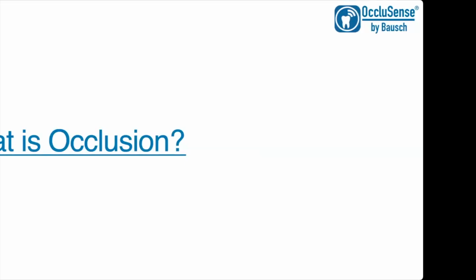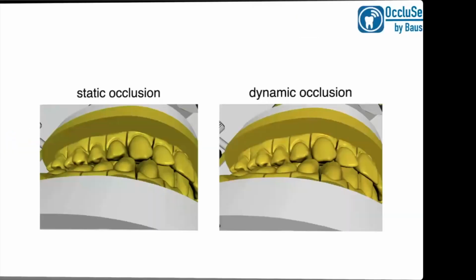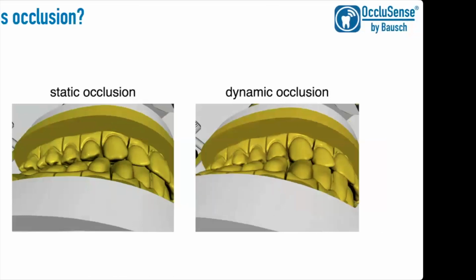OccluSense is occlusion in a digitalized manner. And in order to understand what is happening when we use OccluSense, I'd like to ask quite a basic question. I want you to think about how you check the static and the dynamic occlusion on your patients in your dental practice.